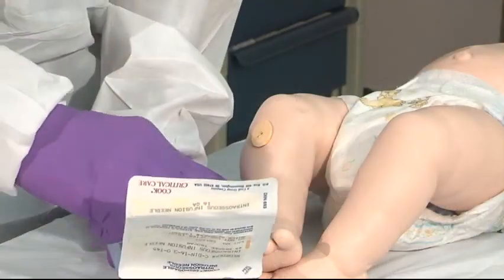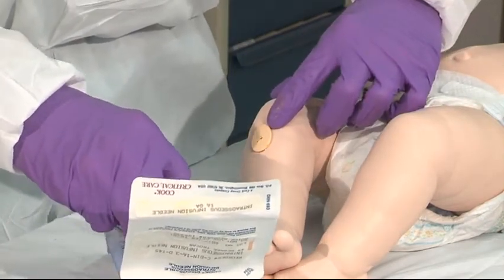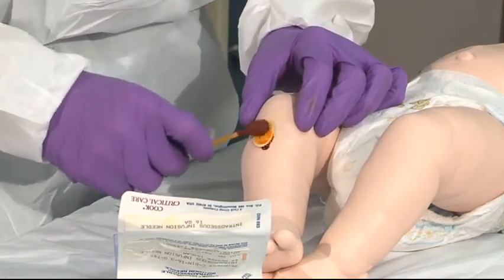The patient area is defined as the anterior plateau, one to two finger breadths below the knee. Use Betadine to cleanse the area.